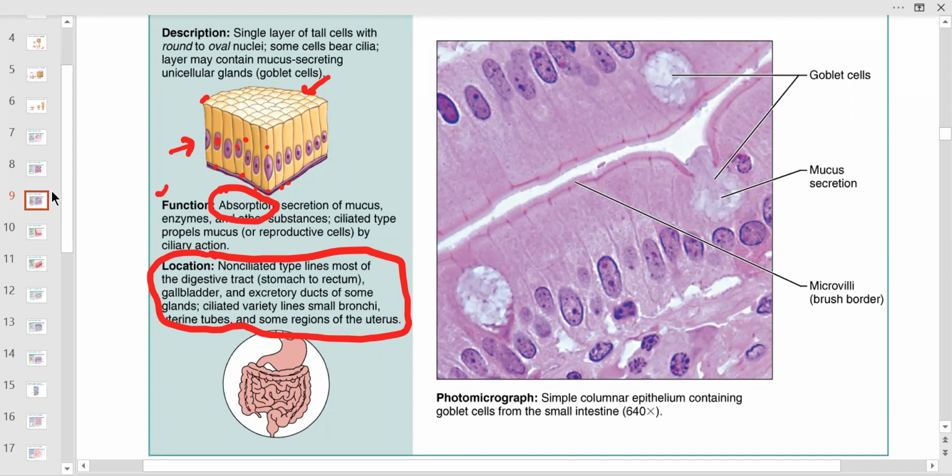So you want to absorb sometimes. Sometimes it's not always absorption, but you want to absorb into these cells. They're more about absorbing, bringing things back in and then going into the blood. So look at this small lumen. Now let's go over to the real histology now.